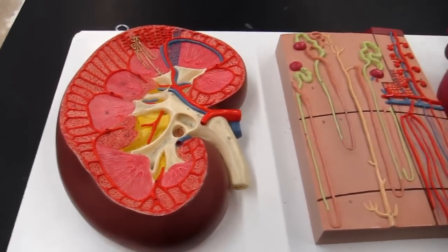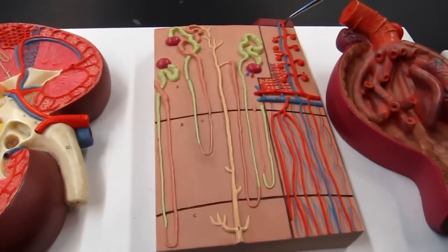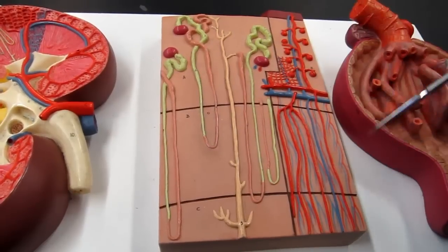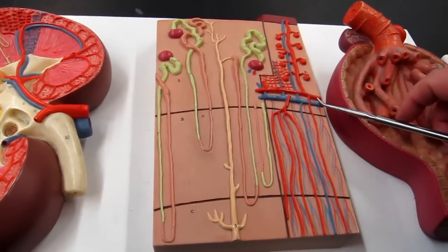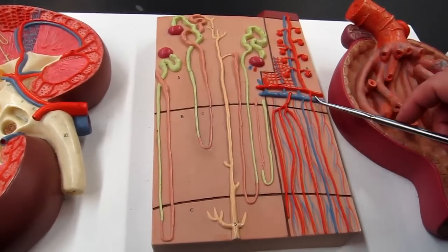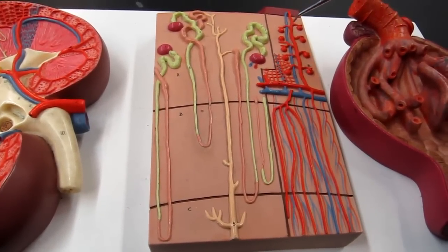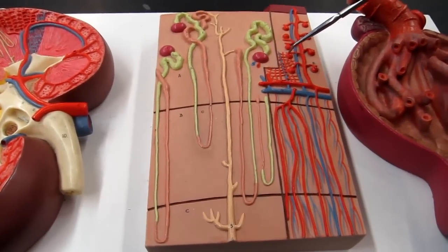Okay, now in this middle section, you can see the capsule again represented here with the dark color, and we can also see more detail of what's in the cortex and in the medulla. Okay, so let's start with the arcuate artery and vein, which should be at the border between the cortex and the medulla. And then we have our cortical radiate artery, and you can see that it looks like there's little grapes or berries hanging off of the cortical radiate artery.